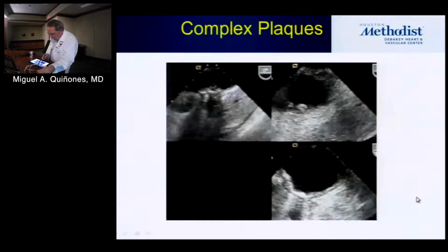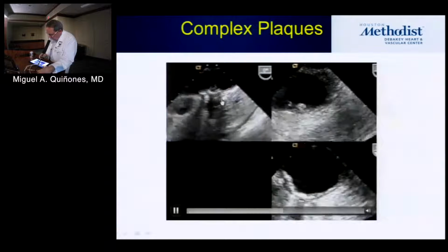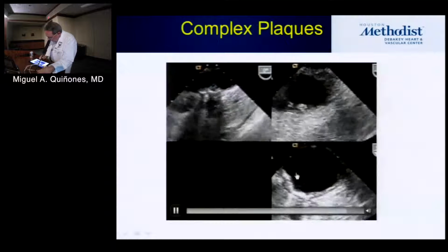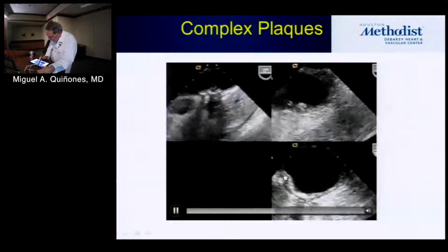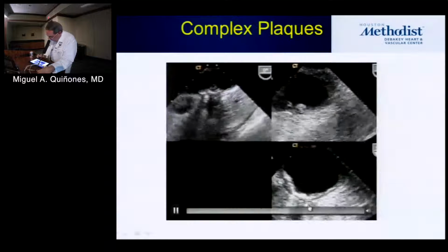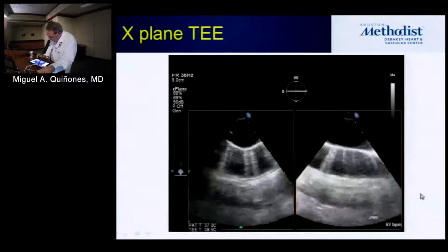And when you see them in real time, as we see them periodically when we do TEEs, this would be like a grade 3, very apparent. And notice that then they have little areas there, those things that are flickering often. If you look around, you can see these little flickering things. So the question is, what are they?